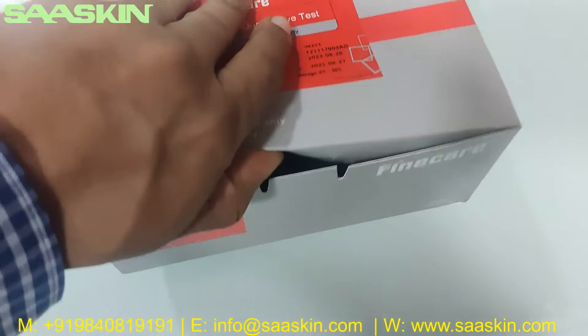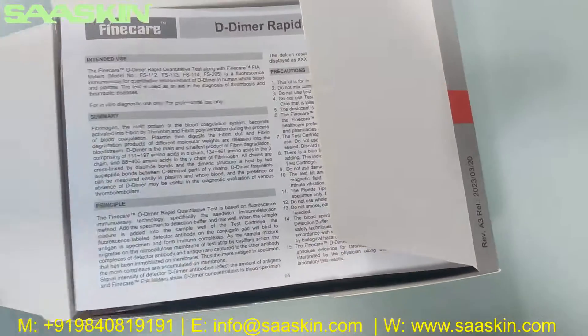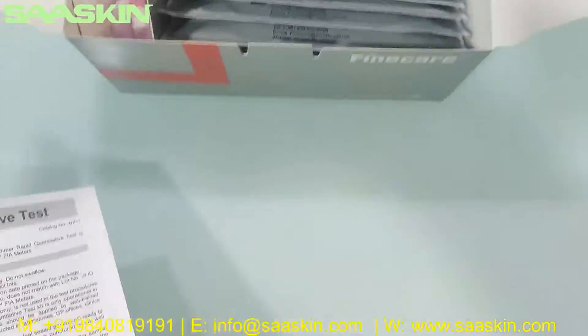Let me open this box for you. Inside the box you'll get an IFU brochure. You can see there's an IFU brochure here.